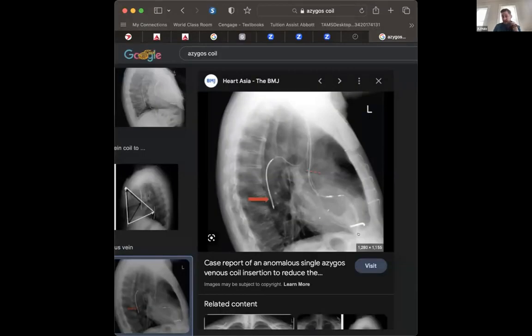No, AJ, please explain it again. Yeah, so basically, let me bring it back up. Sorry, I stopped sharing. So basically, in general, just like with your patches, you want to have a good vector to engage as much cardiac tissue as possible. And there are considerations about where you'll put it. Some of these patients with extremely dilated hearts, or very muscular hearts, can be kind of hard to defibrillate.